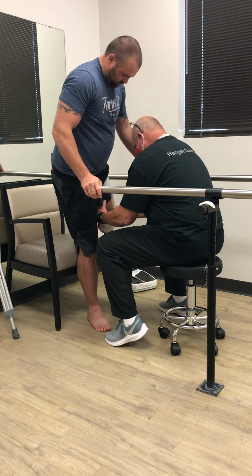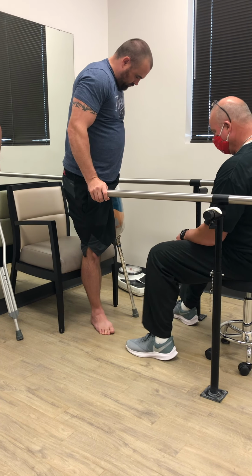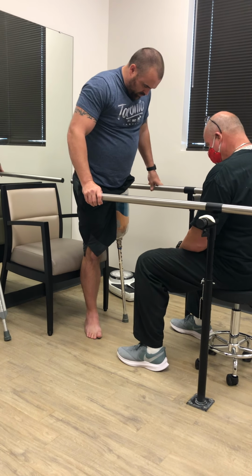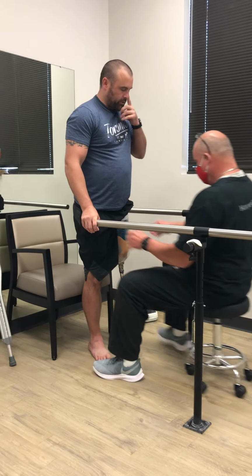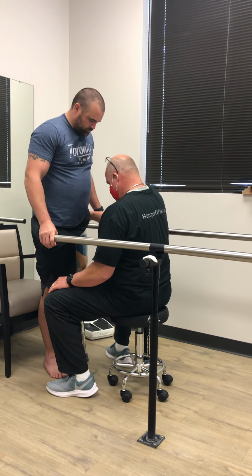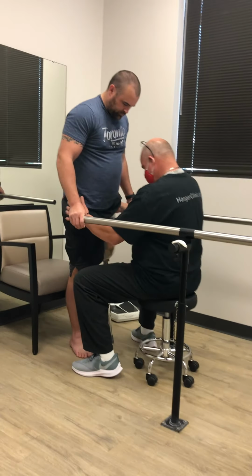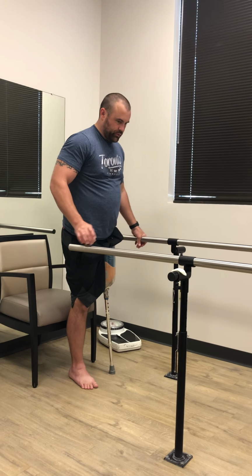Alright, see what we get. Now that's where we had it last time, as far as the height and everything, so we should slide right in. All I really did was bring that hip in some. So, yeah, it's a lot better. It could be slightly different just because I want a shoe on.